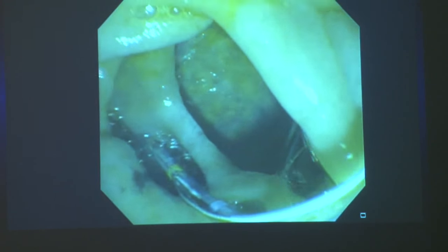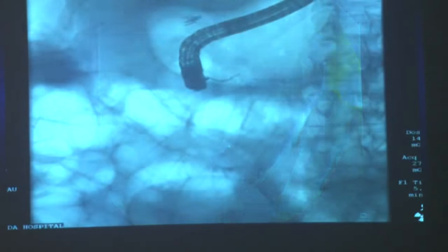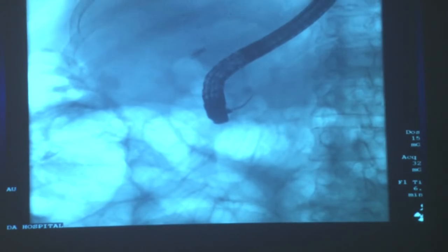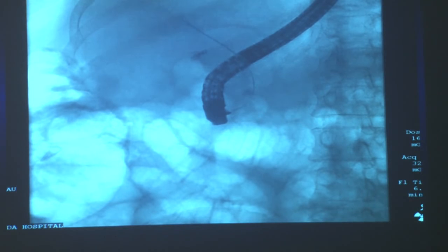This is another one — completely inside the diverticulum, far away, and a very small papilla. After going in, the wire is not going anywhere, just keeps hitting. That's why I injected to get an idea where it is. After getting the idea, you go in and try to maneuver your wire. Sometimes I do the wire myself — if you take your glove off and rotate the wire, it's just a rotation, and like a snake it finds its own way. Here it wasn't working, so I injected to get an idea. When you inject, the contrast comes back and goes up — that means I'm going away from the angle of the bile duct. So I have to come back while engaging the papilla itself.